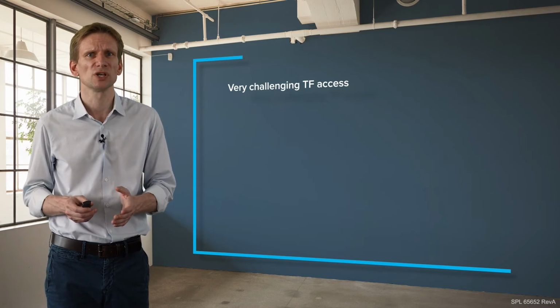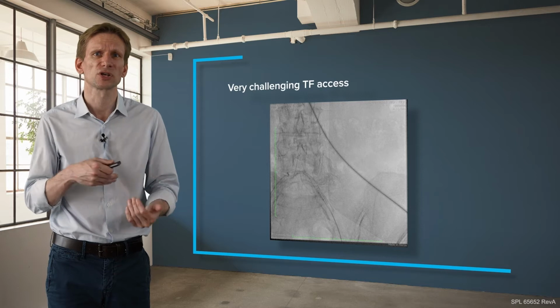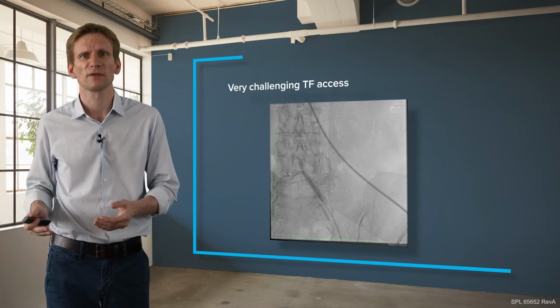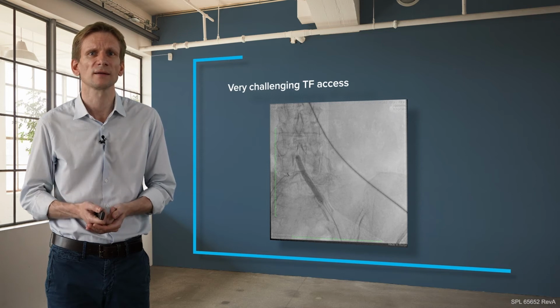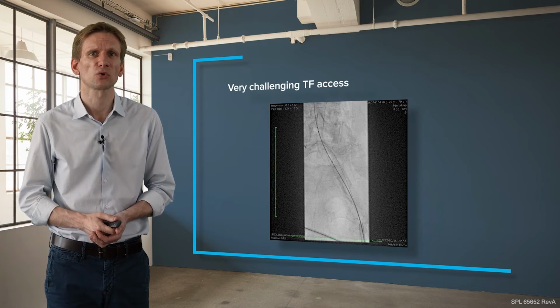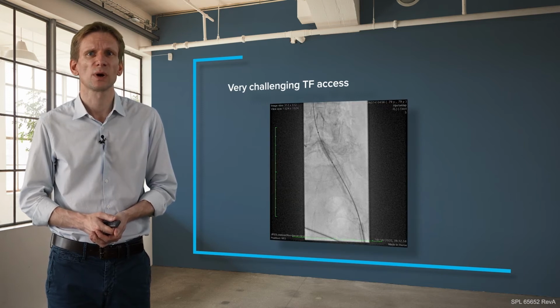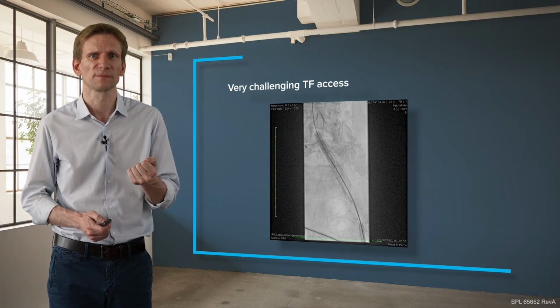So again, as you see, I have a safety wire from the right leg crossing over to the left leg, and then we have this coronary wire, or 0.014 wire, where this is the IVL catheter with the shockwave balloon on top. So this is where we do the expansion. We inflate to 4 atmosphere. When the balloon is inflated to 4 atmosphere, we give our IVL therapy and our sonic pressure waves.